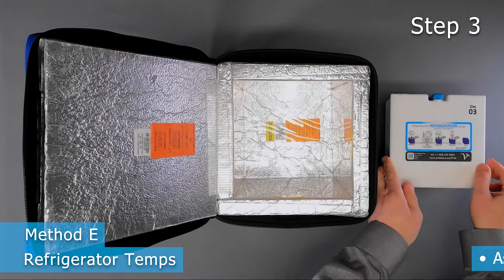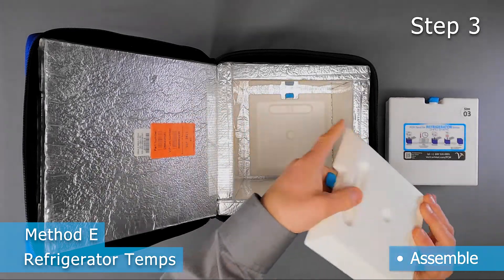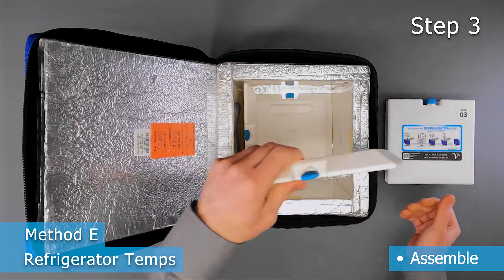Step 3 is assembly. A bottom panel goes in first, followed by the 4 sides.